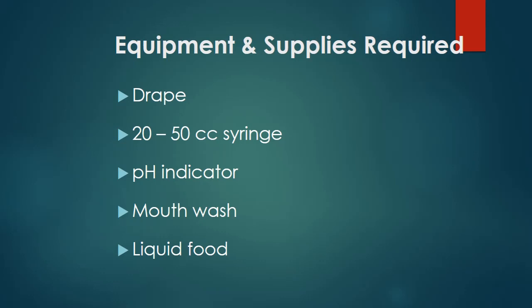Then we need items for mouthwash. Remember when we were treating Basic Nursing 1, we said the category of patients likely to suffer from a neglected mouth was those undergoing tube feeding. Because we are always giving the food through the tube, we should not neglect the patient's mouth. So it's always advisable that if you have an unconscious patient or a patient in a very critical condition, whenever you feed the patient, it's important to also wash the mouth of the patient.